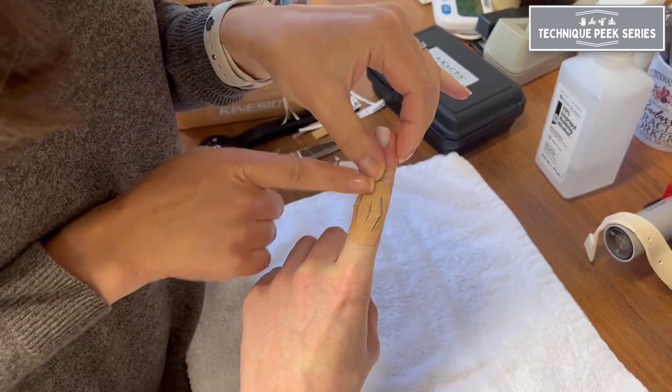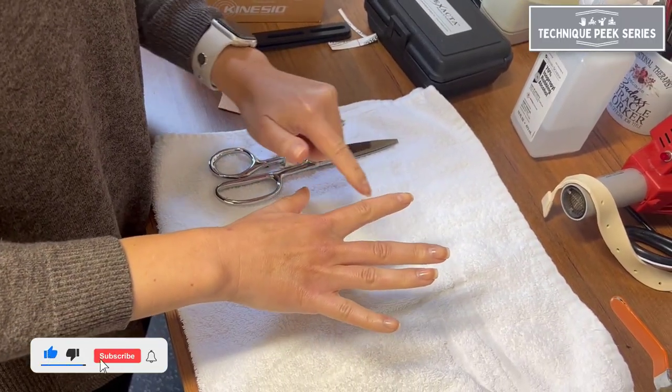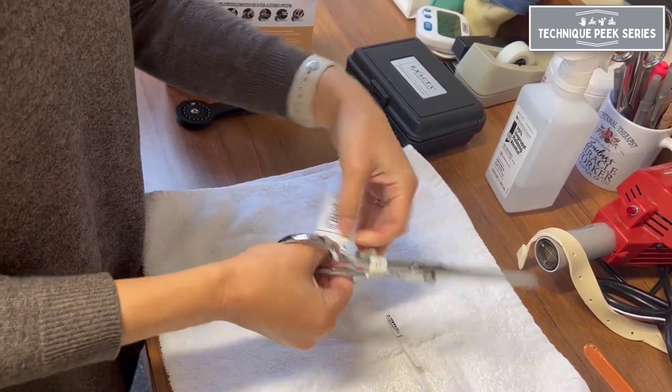Today we're going to demonstrate a taping technique for edema control over the dorsal PIP joint of the finger. You'll want to start with a small piece of material that spans from the midpoint of the proximal phalanx to the midpoint of the middle phalanx.